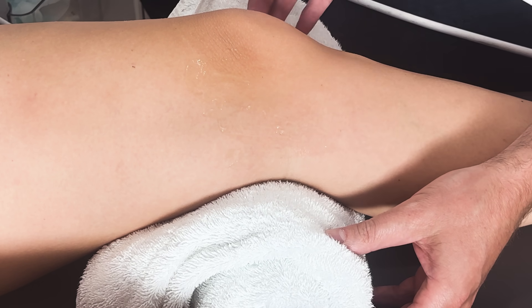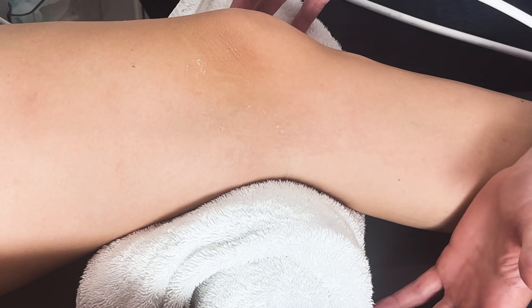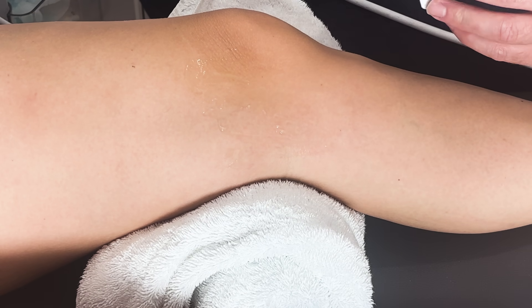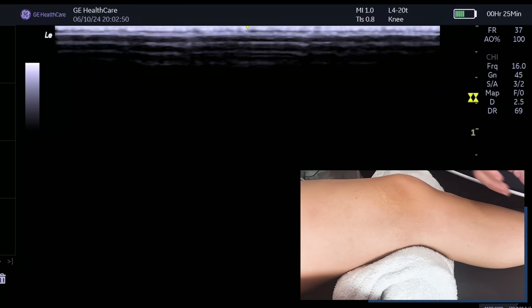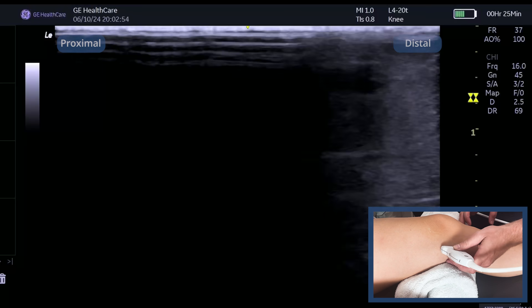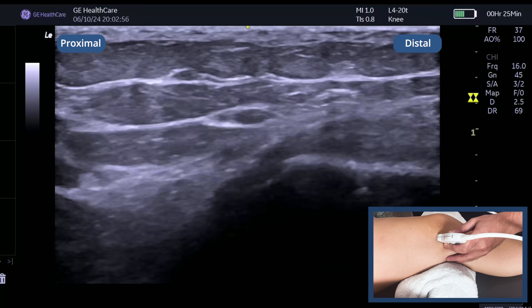The key thing to remember is that you may need to have a small towel under the knee, or it might be easier to have the knee straight or potentially even at 90 degrees. You do need to have a play around with the patient position. The first thing you're going to do is just place the probe onto the knee joint.